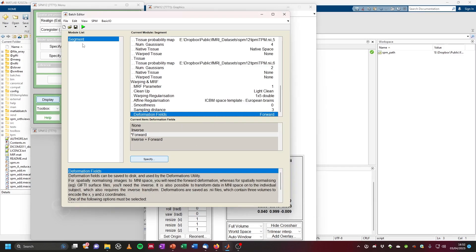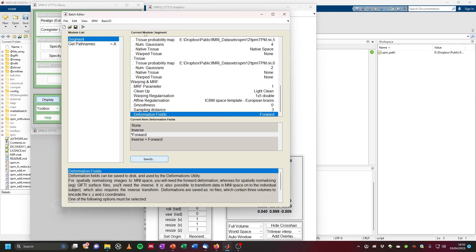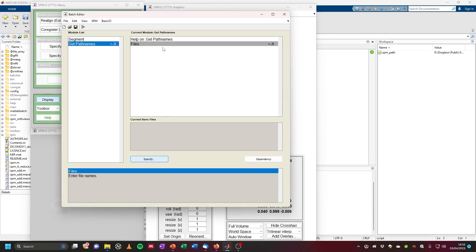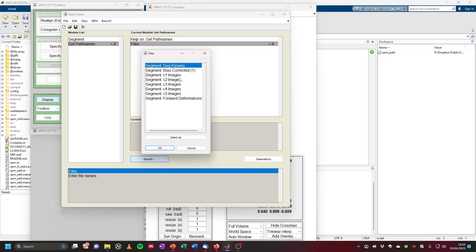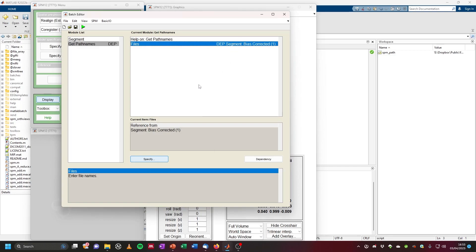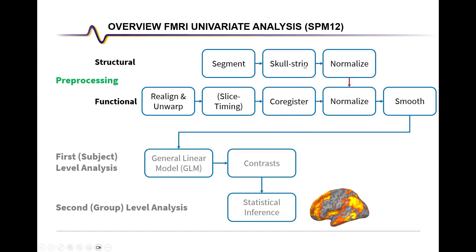As the next step, we can get the current folder where the output image is saved by clicking on basic IO, file operations, get path names. This is just to get the folder where the structural images are stored. For the files, we use a dependency — right click, then dependency, and select the bias corrected image so it gets the path of that folder.